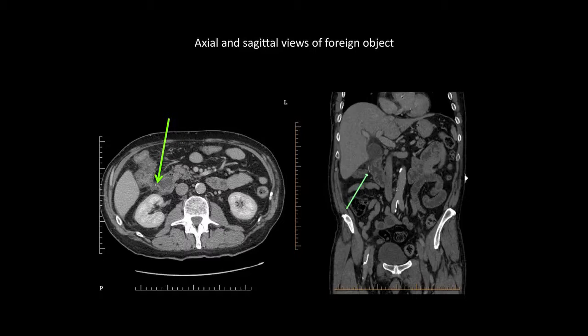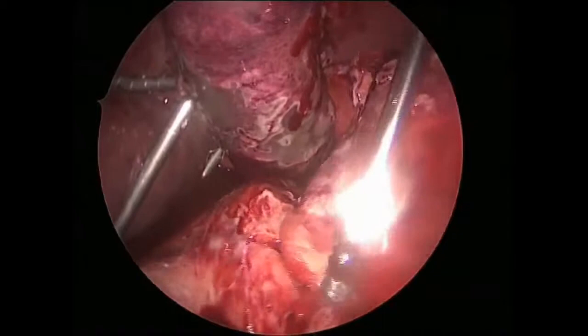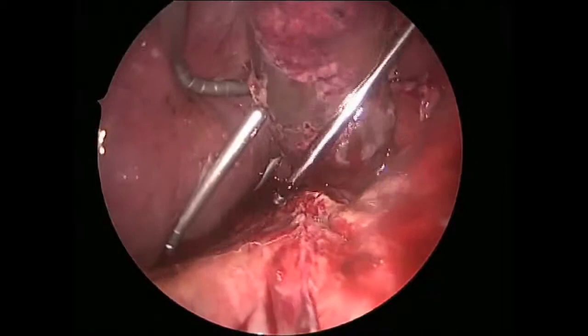It was discussed with the patient and he was consented for a laparoscopic exploration and foreign body removal with cholecystectomy if intraoperatively indicated. General anesthesia was induced and the patient was placed in a split leg position. We inserted our trocars as we would for a laparoscopic cholecystectomy. We inspected the abdomen and turned our attention to the right upper quadrant, where a phlegmon around the second part of the duodenum was found.